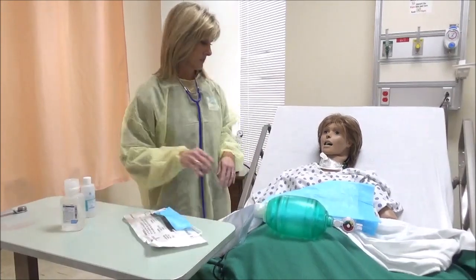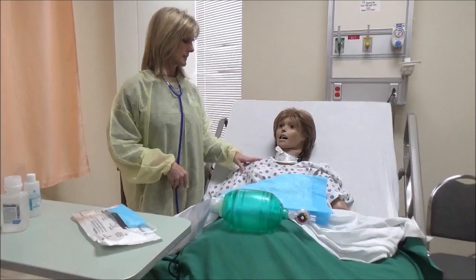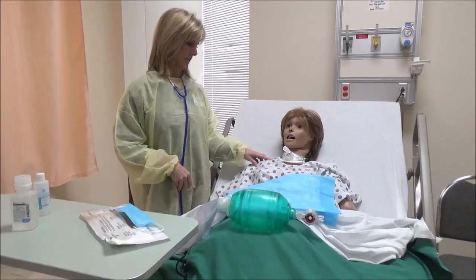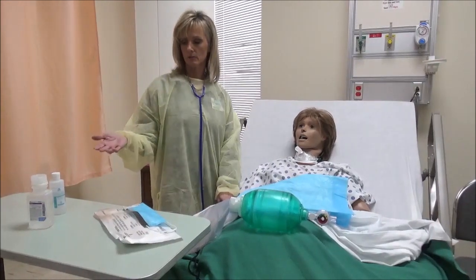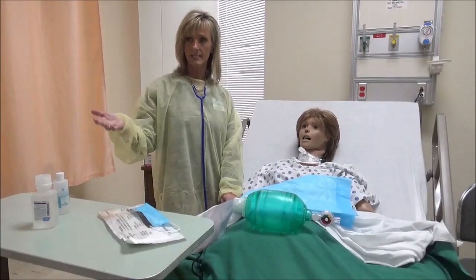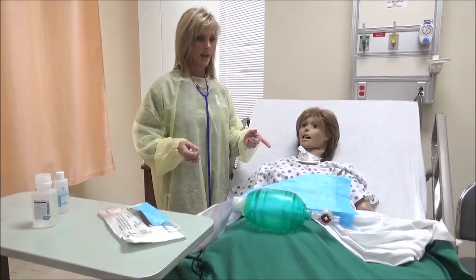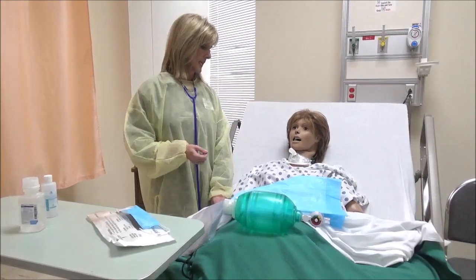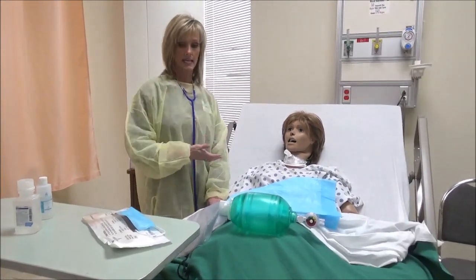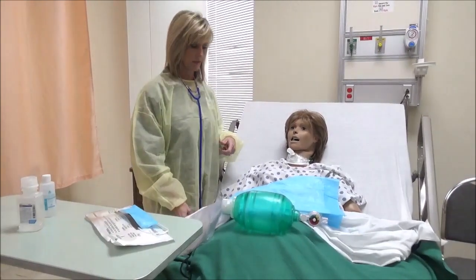So I come in and I've gathered my equipment. I'm going to explain the procedure to the client and make sure that I identify them. Now, because they have an artificial airway, that can be challenging, so I can check their armband against their medical record, electronic medical record device that I have, and I could also, if there was a family member in the room, have them confirm that I have the right client, or if the patient can communicate somehow, I could have them mouth their name to me.